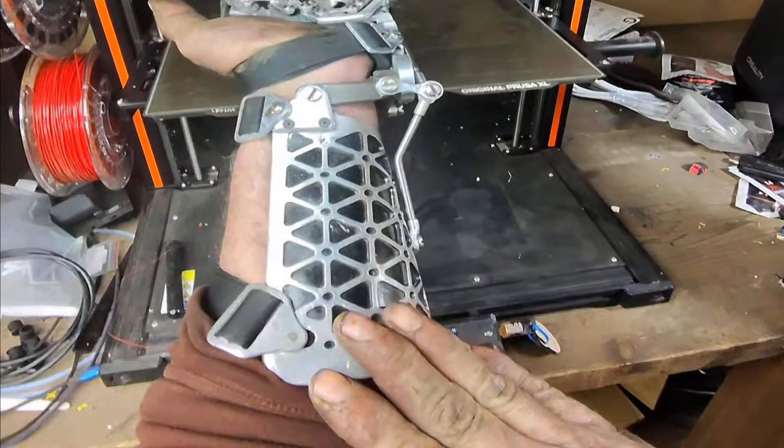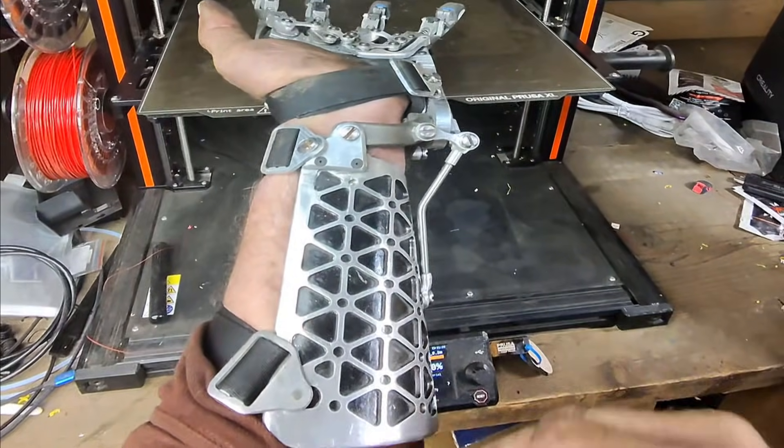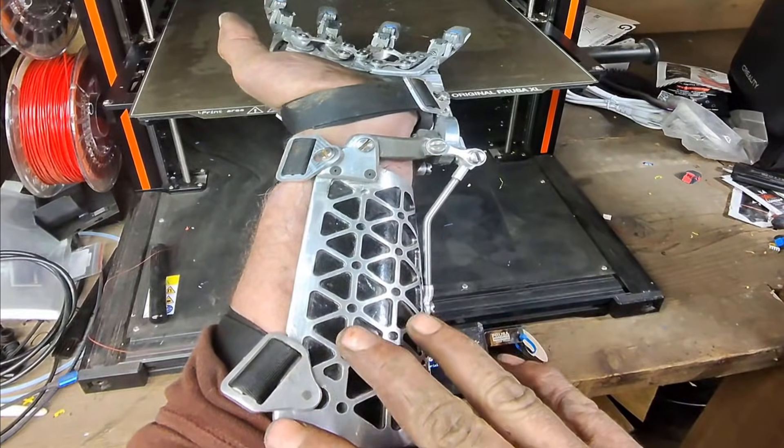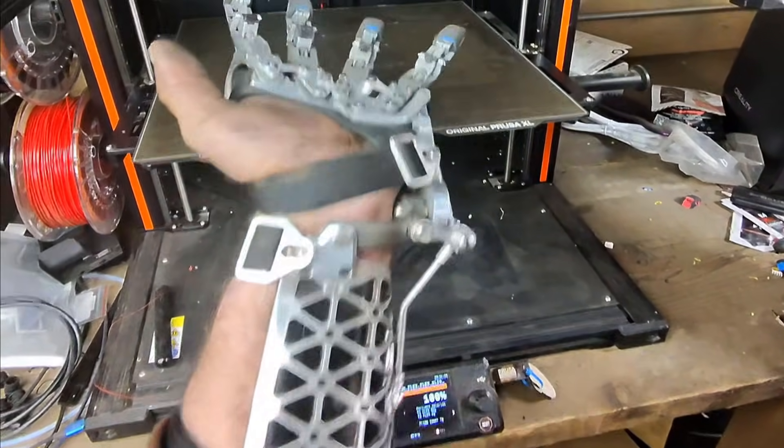The forearm cuff is all aluminum 6061 T6 — I ended up machining it, then heating it up to the annealing point, and then forming it in my urethane press brake die.